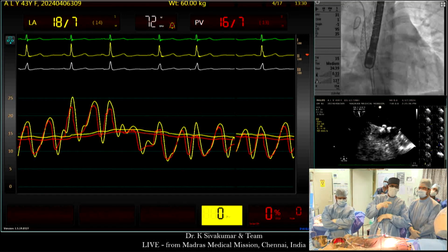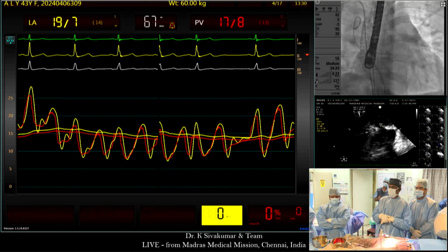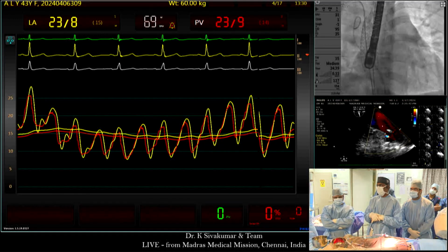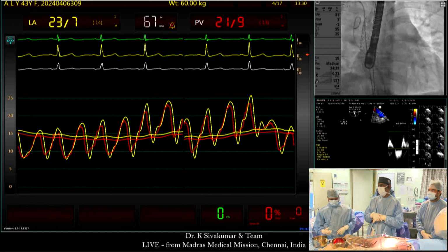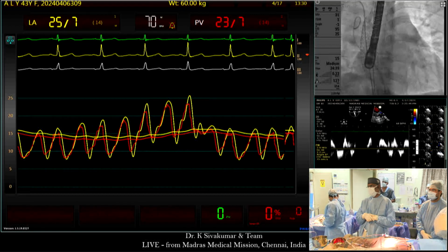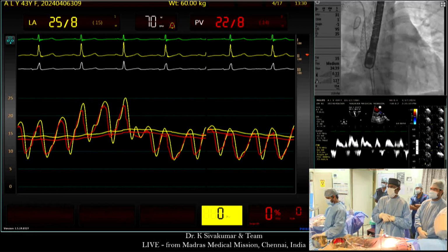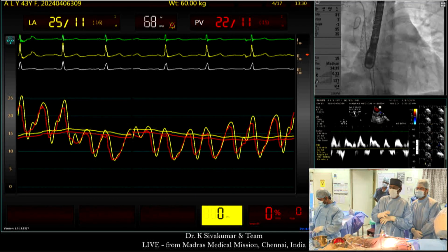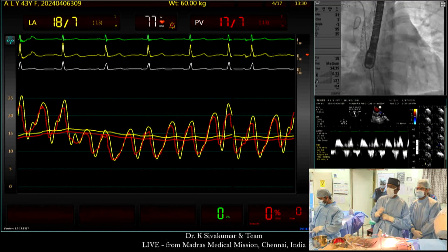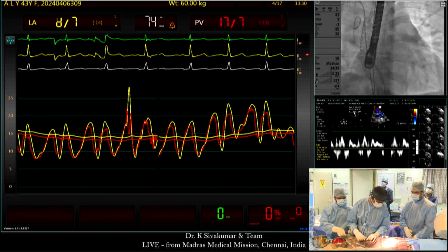In fact we were able to see little flow reversals in the spectral Doppler flow on the pulmonary vein. See that now in this. Can you put a Doppler again? We can appreciate that the flow reversals are also a little prominent. What is coming towards the transducer is the flow reversals, and they are prominent, indicating some amount of restrictive LV physiology.